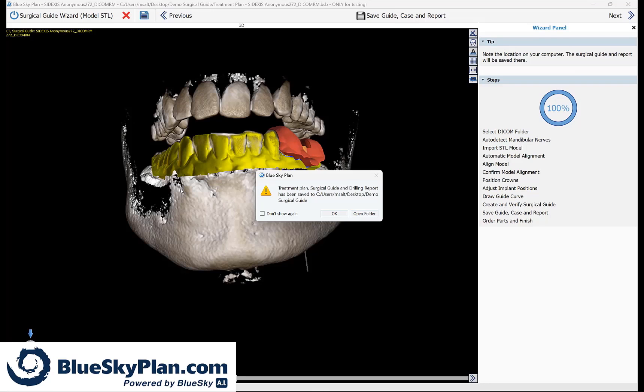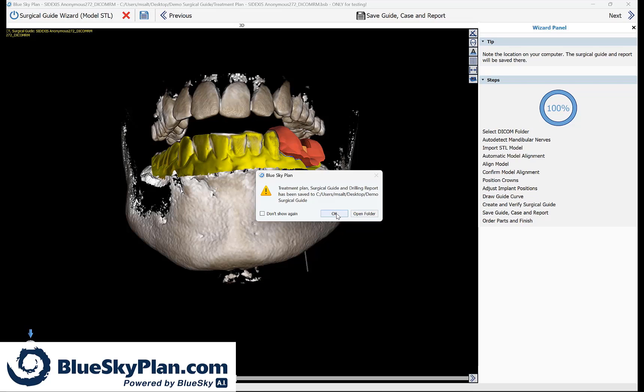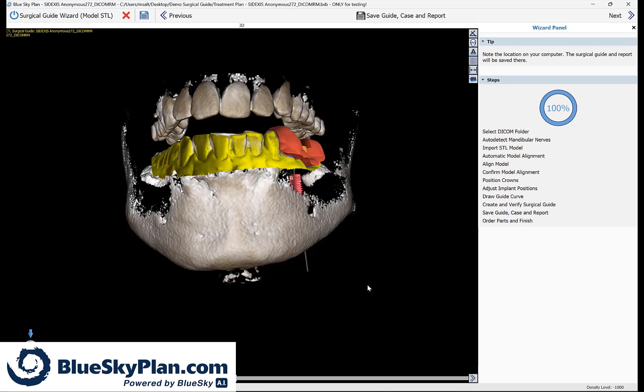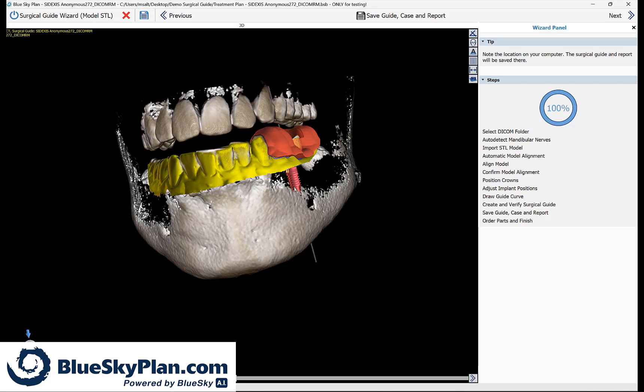And we could see the automatically generated drilling report that's saved to the folder. And if we refer back to Blue Sky Plan, the treatment plan and the drilling report has been saved to the folder. And that is how to plan a one implant case using the step-by-step tutorial and the new automatic implant placement.